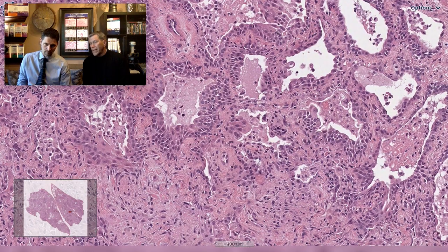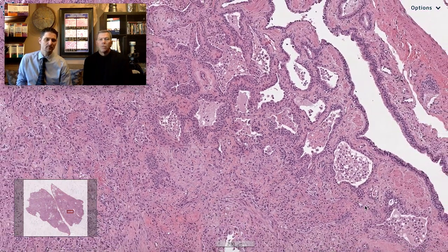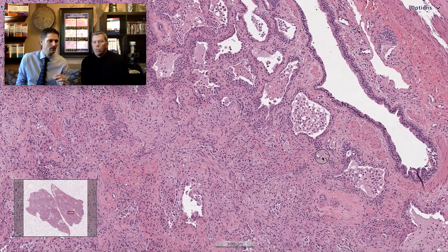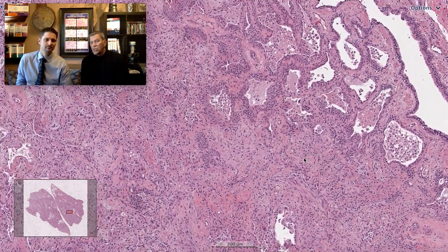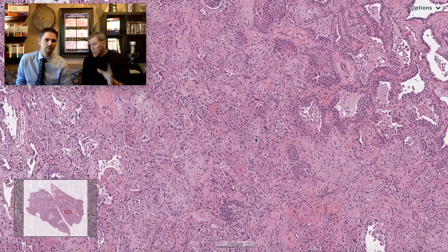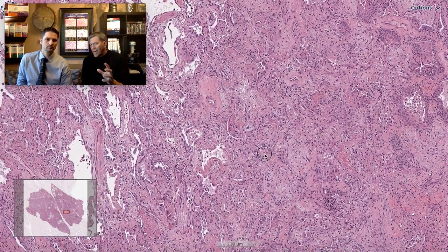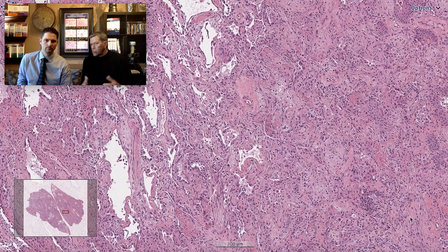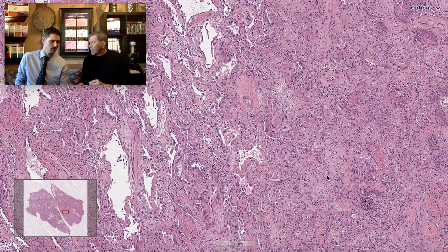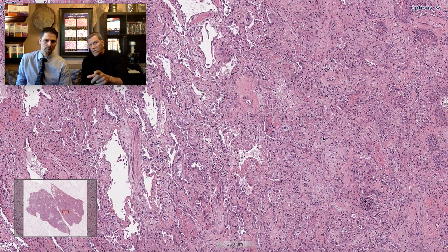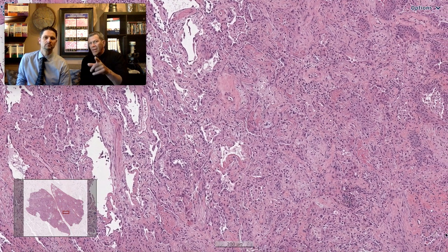Especially organizing diffuse alveolar damage. Now, what would we look for if we wanted to make a diagnosis of organizing diffuse alveolar damage, or acute within organizing diffuse alveolar damage? That's the tricky part — most pathologists think of diffuse alveolar damage as having one phase, meaning you biopsy the patient and they have hyaline membranes throughout, or you biopsy them later and all they have is organizing pneumonia — like what we might see here. This is a lot of organizing pneumonia and it looks like multiple stages.